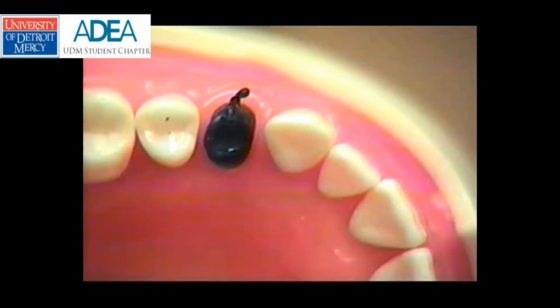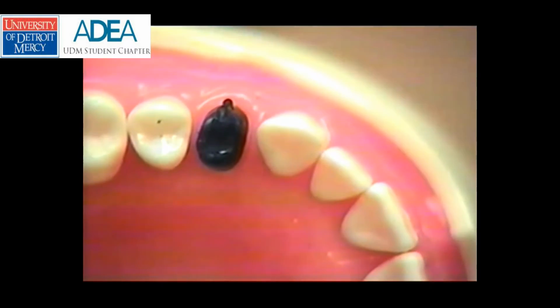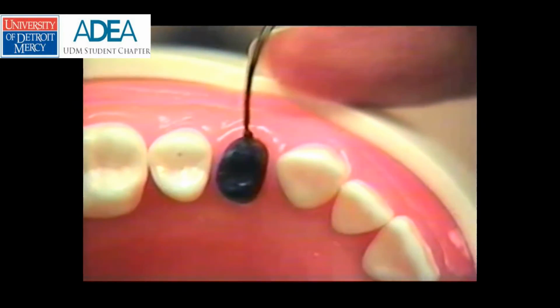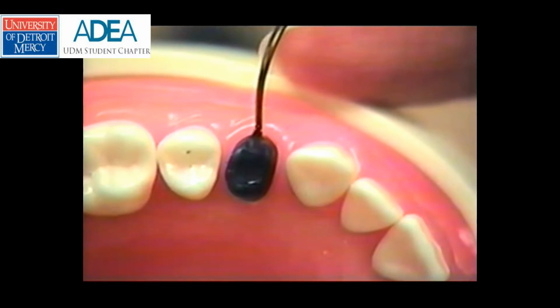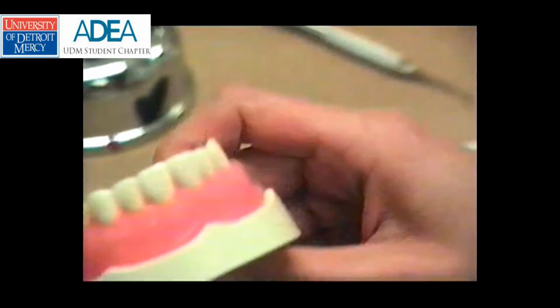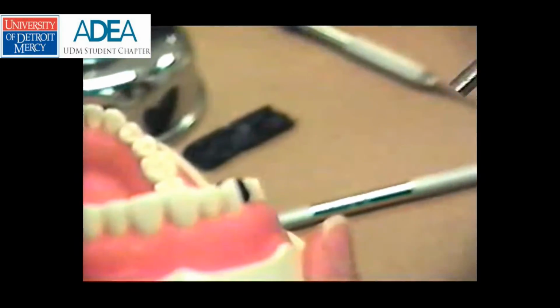And you can note how I'm moving the wax here. You guys want to just kind of, as you're watching me, you can even try and do some of this along with me. That's fine with me. And I'm going to look at it like this. And I want to see everything in a line, okay?